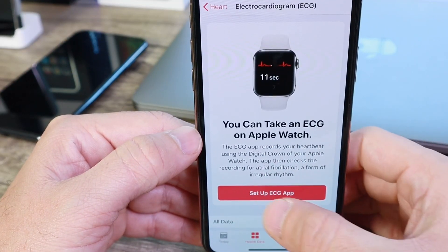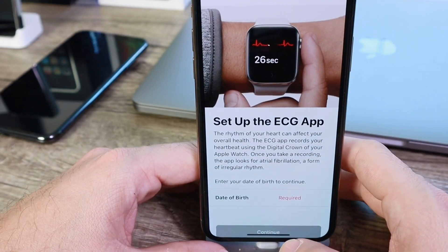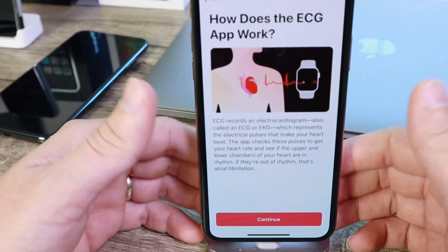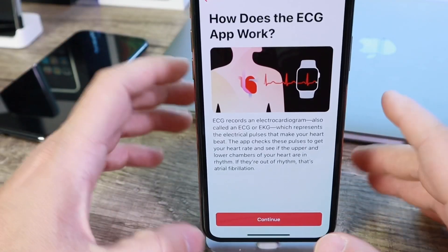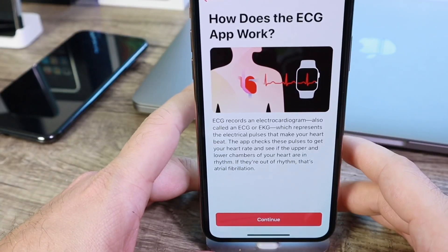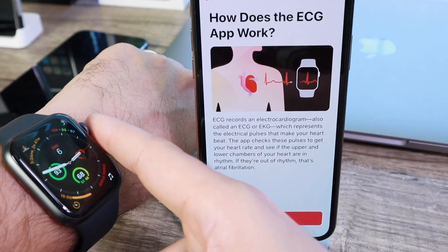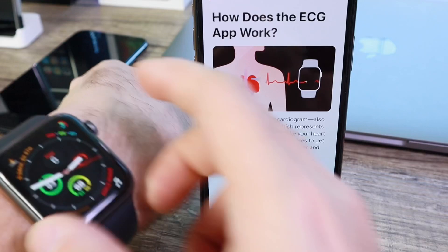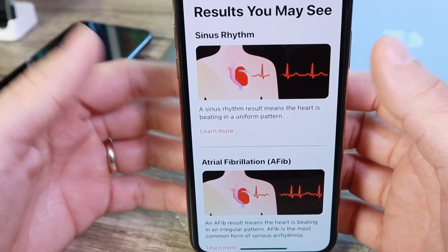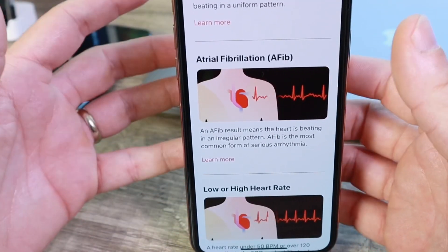Here's the setup splash screen. I'm doing this for the first time, so let's enter my birth date and continue. There's a quick animation explaining how ECG works. This splash screen explains that the Apple Watch ECG is tracking for AFib — an irregular heartbeat — using the digital crown on your wrist. The digital crown is a sensor on the Apple Watch Series 4. It also explains sinus rhythm, which is the normal heart rate pattern that most of us have.